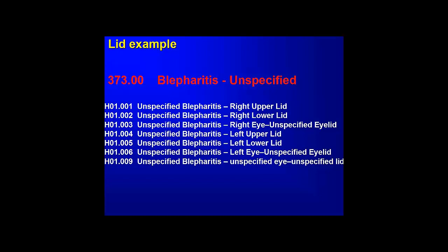If you use this code, you're in the wrong field. It's just one of the ridiculous particular things. Everything's unspecified. I can guarantee you that if not immediately, very quickly, that code's going to be denied if you ever try to bill it. So that's why I have this particular example in here.